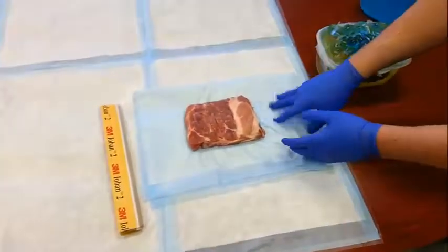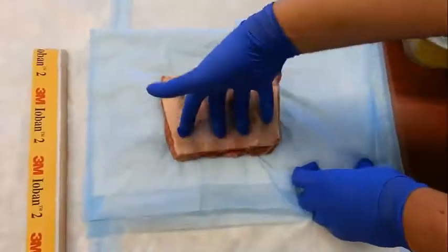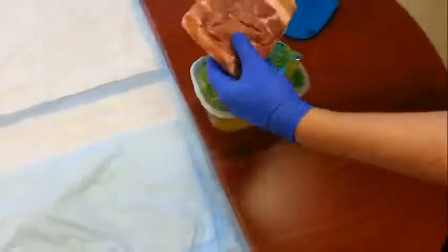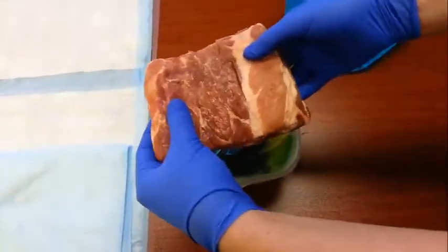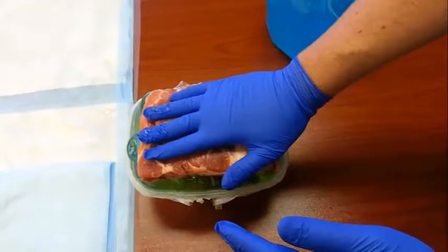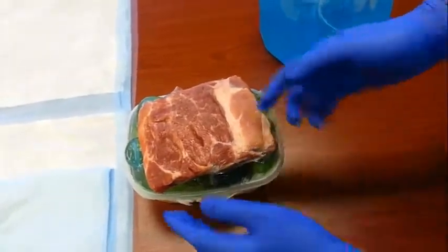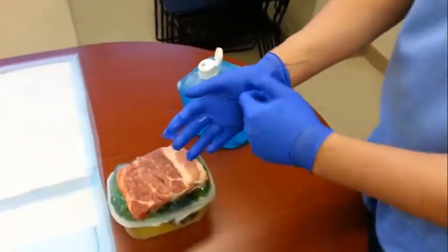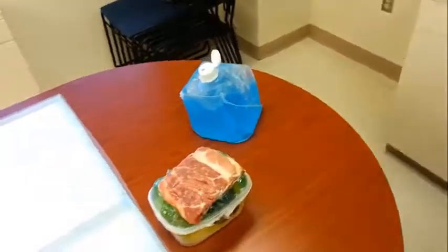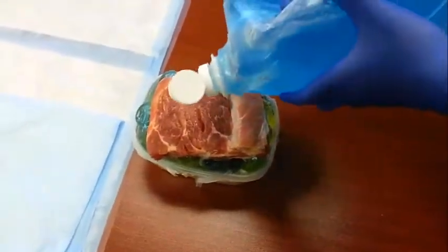For using your ribs, here's a small slab purchased at any butcher shop. The ribs lay in this orientation, kind of right where my fingers are. For the purposes of the model, setting them up anatomically how you'd want the view to be — nestle them right on that pillow of gel, which fills in all the air underneath. Have them a little bit oblique to recreate the anatomy. Then take off your dirty pair of gloves and apply another layer of gel on top, so you haven't contaminated your bottle of gel.